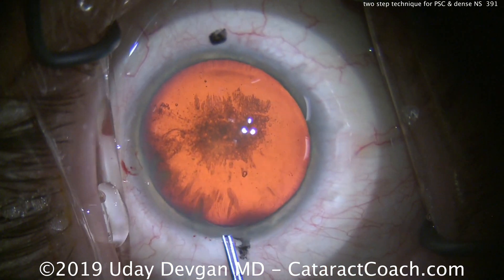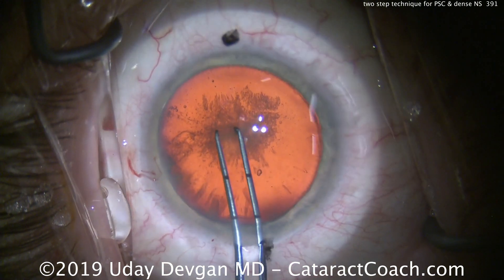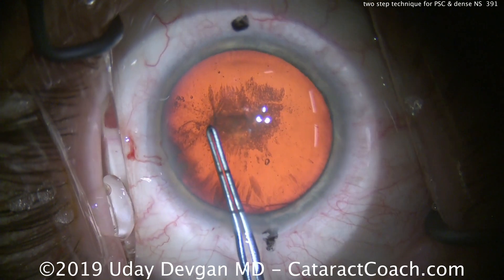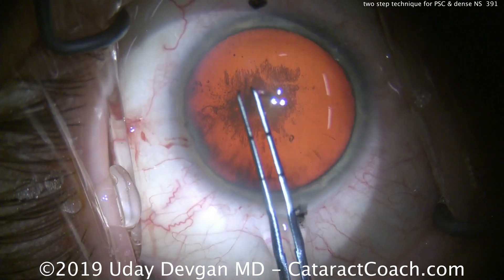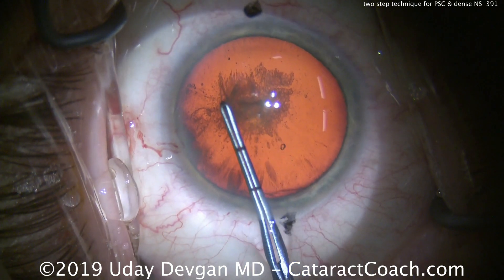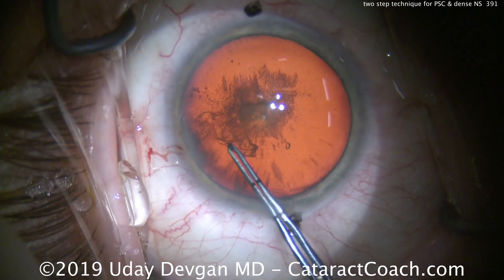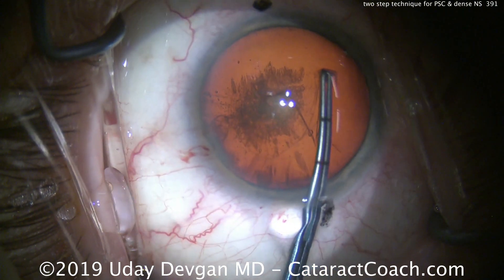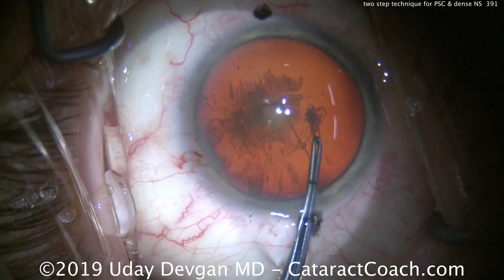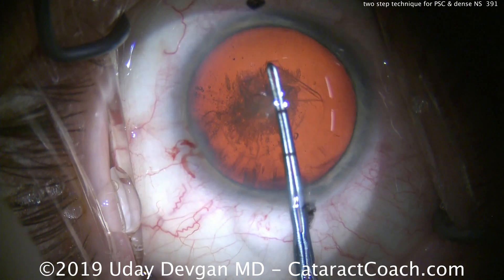Now we'll get our capsulorhexis forceps and we're looking for a nice five and a half millimeter capsulorhexis. We'll poke in the center and center this up beautifully. The middle mark on the forceps is two and a half millimeters from the tip and the other mark is five, so we'll aim for about five or five and a half. We continue here — it's nice and round, curvilinear, bringing this all the way over to complete it.